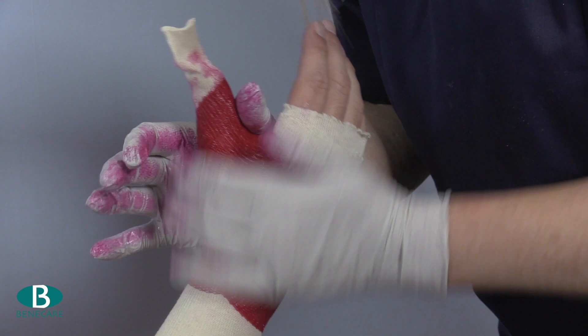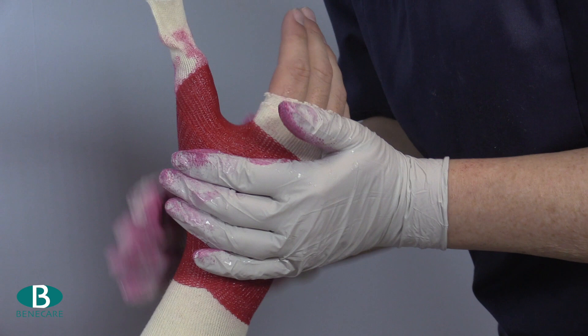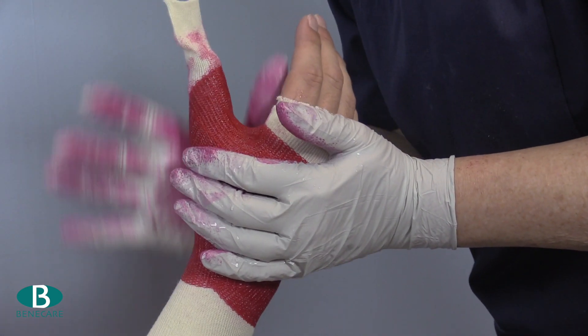Mould the cast and allow it to reach the initial set. This process could take between 4 and 7 minutes dependent on the dip technique.